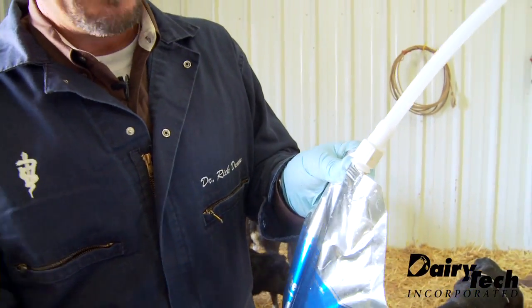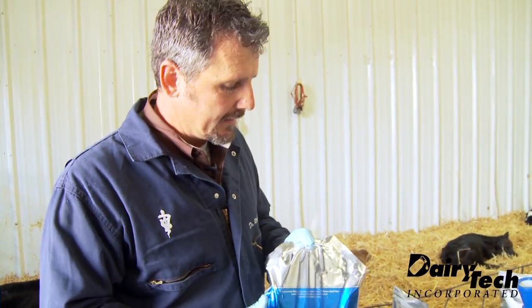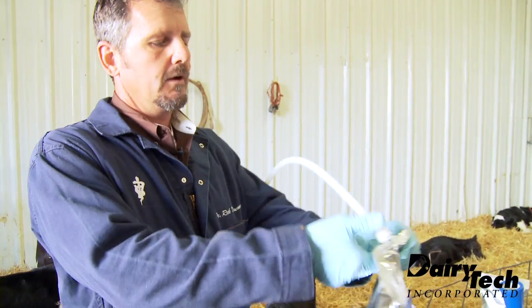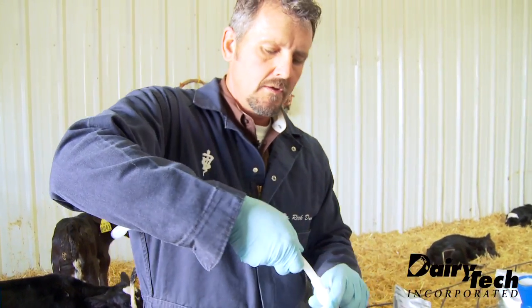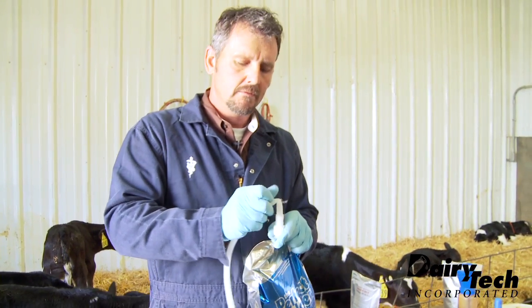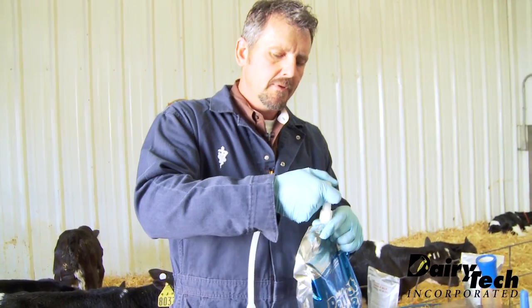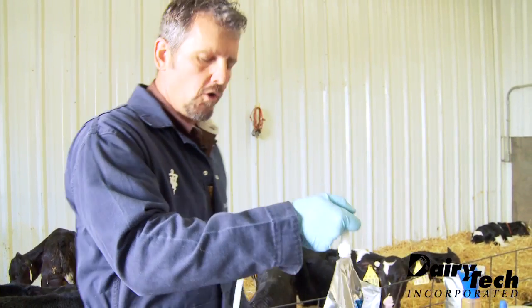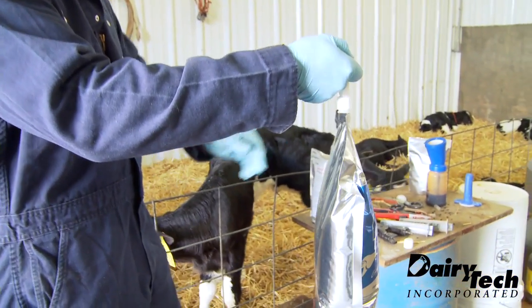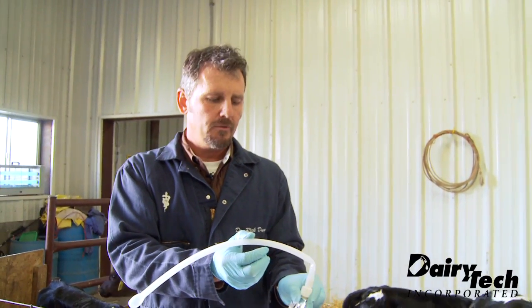Now, for feeding with the tube, sometimes I prefer to not use the bag carrier. That allows me to approach the calf with the tube kinked — I'll kink over the tube, it won't break. Now I can hold the bag with one hand as I put the tube down the calf's throat.